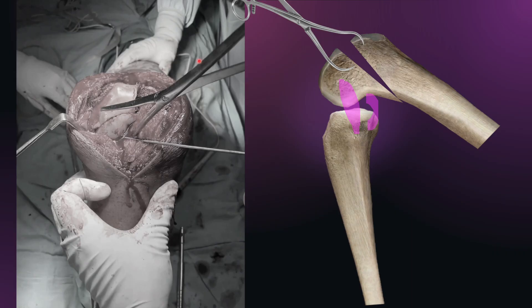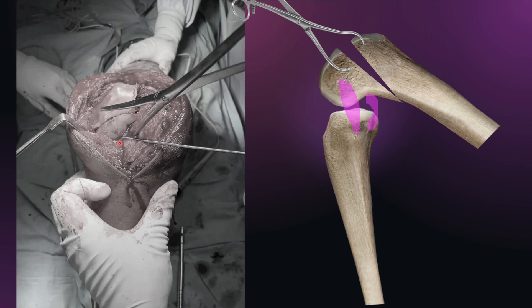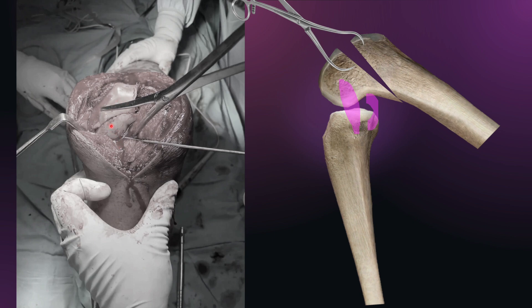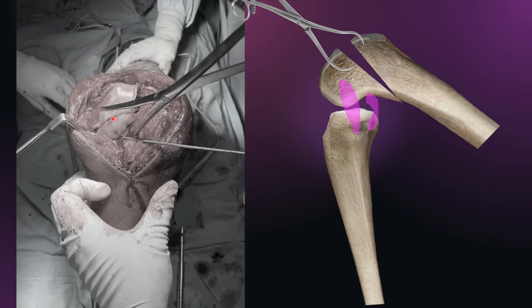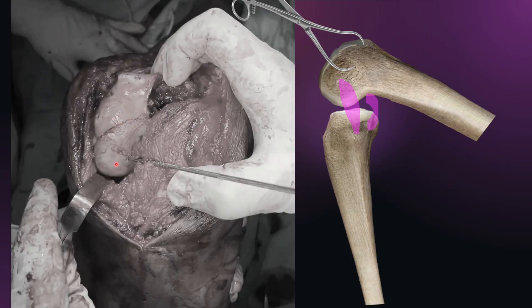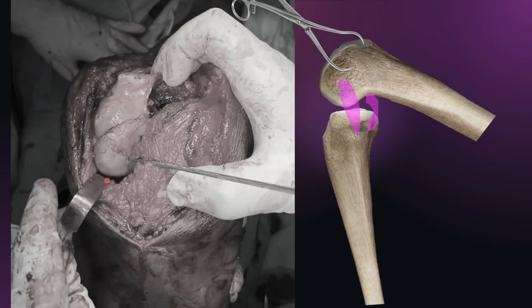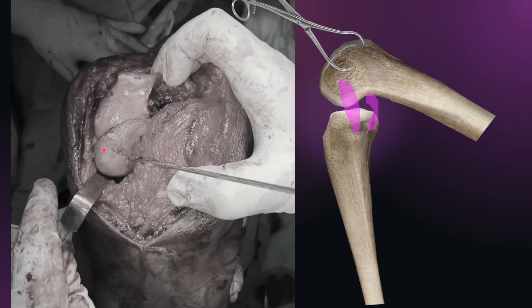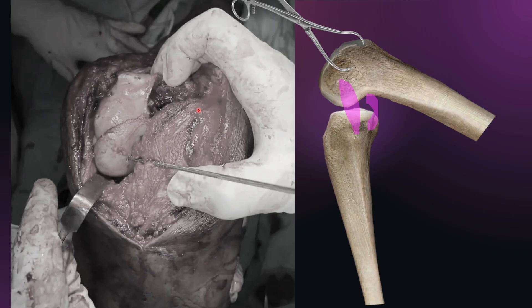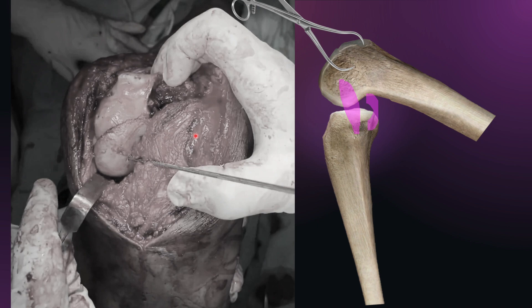This maneuver is quite simple. One assistant is holding the femur while the other assistant is simply lifting the proximal tibia anteriorly. We are able to visualize the joint perfectly — the whole condyle is visible. Reduction has been secured with the help of a reduction clamp and K-wires. You can see how good compression is achieved. If you want to see more posteriorly, you can simply place a Langenbeck retractor, and then you will be able to see the whole condyle.